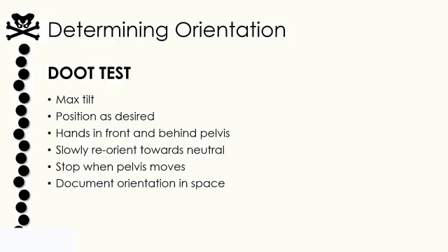So once you've determined that orientation, in early intervention it may be a very minor change. And so we may just measure the distance that we have them tipped under the casters, or we would somehow measure that tilt angle. So the relative absolute angle, measure the orientation angle.